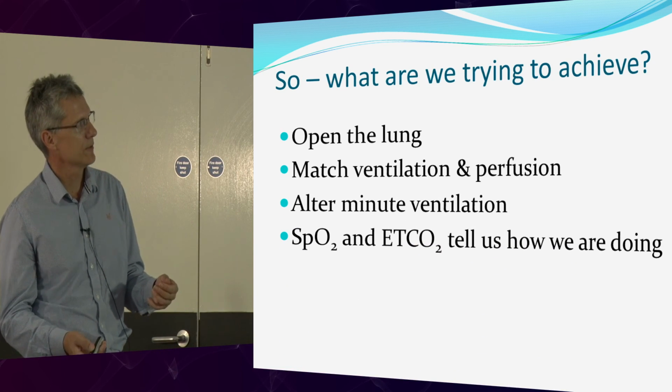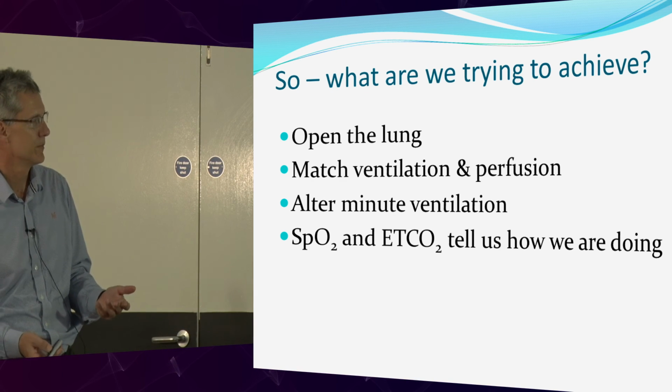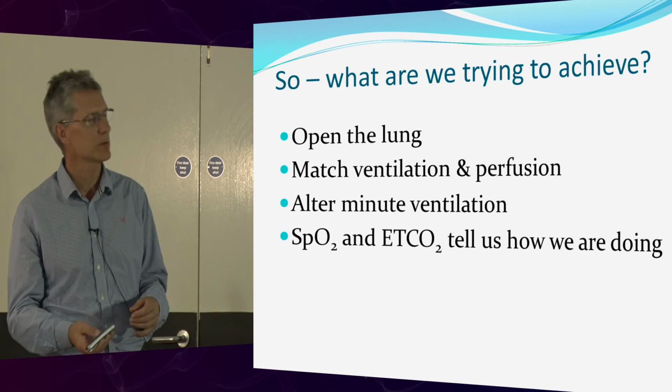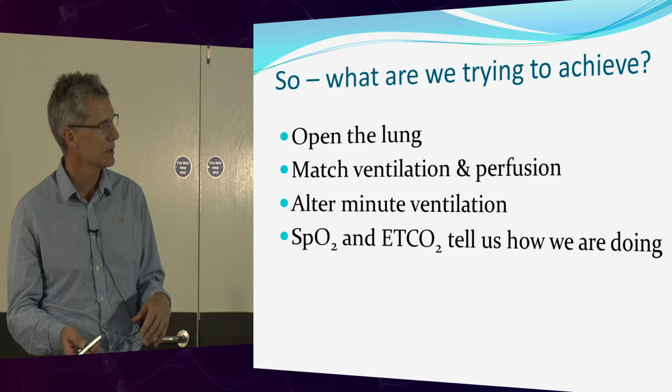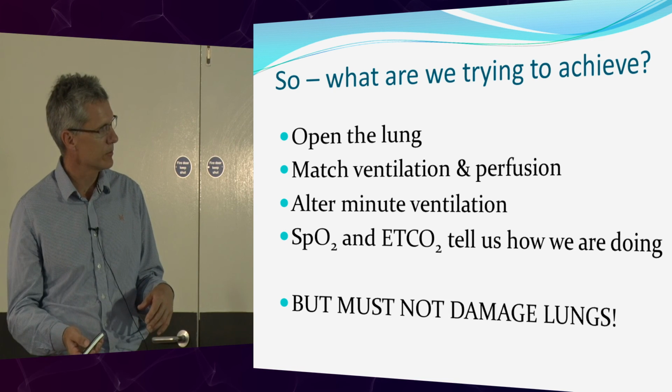So what are we trying to achieve? Open the lung, match ventilation perfusion, alter the minute volume, and saturation end tidal CO2. Most of the time it tells you how you're doing pretty much straight away. And then we've always got this thing as well, we mustn't damage the lungs.